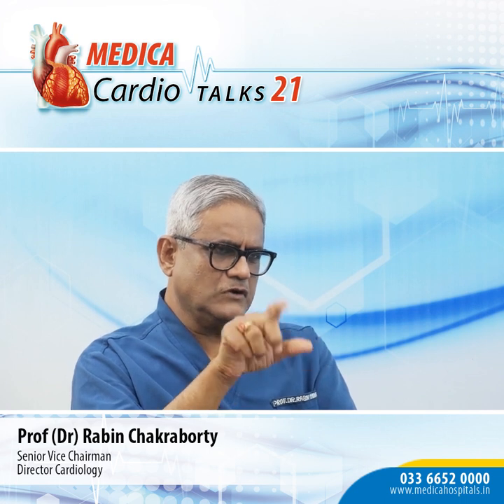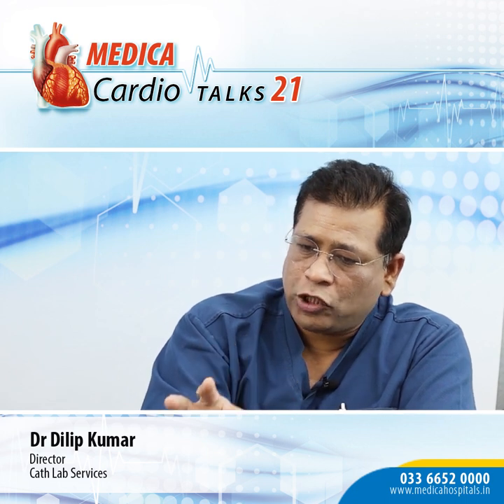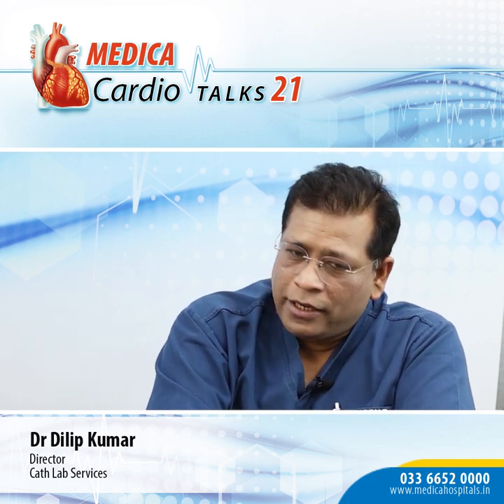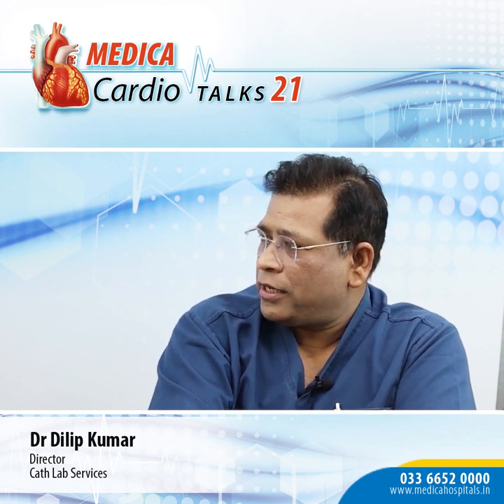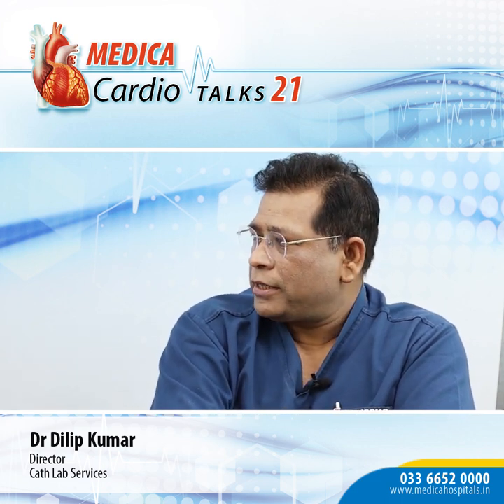You mentioned that there is a coronary artery very close to the tricuspid annulus, about 3 millimeters. What about the atrioventricular node? Yes, these are very close, and with surgical tricuspid valve replacement, chances of pacemakers are 35-40%. So it's a real concern. With the AV node and very close coronary arteries, whether you go surgically or percutaneously, or you're putting a device or valve there, these are going to cause a very high chance of pacemakers.